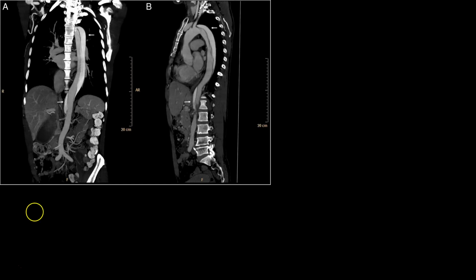What happens in aortic dissection, as a brief reminder, is that you have a small defect within the wall of the thoracic aorta or the abdominal aorta. And what happens is, because of how high pressure the system is, blood tends to pump into that area and it starts to shunt straight down into the false lumen, creating this huge big tract. You can see right here, this is the false tract of the aorta that's built right here. And then this is the real abdominal aorta, thoracic aorta and abdominal aorta splitting into the iliacs. So this is a nice, very clear image of what that would look like.